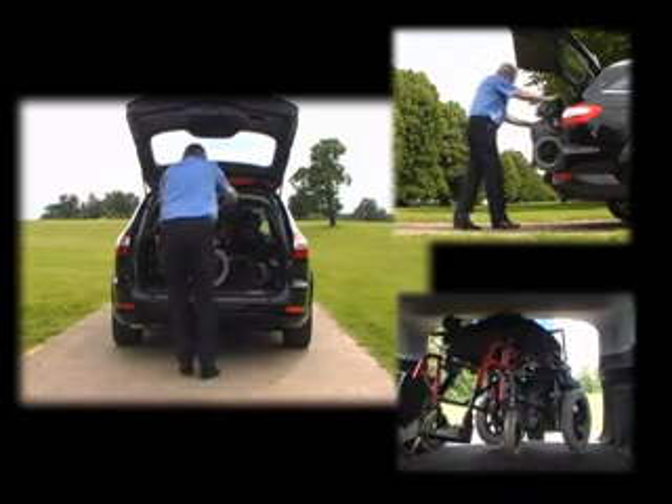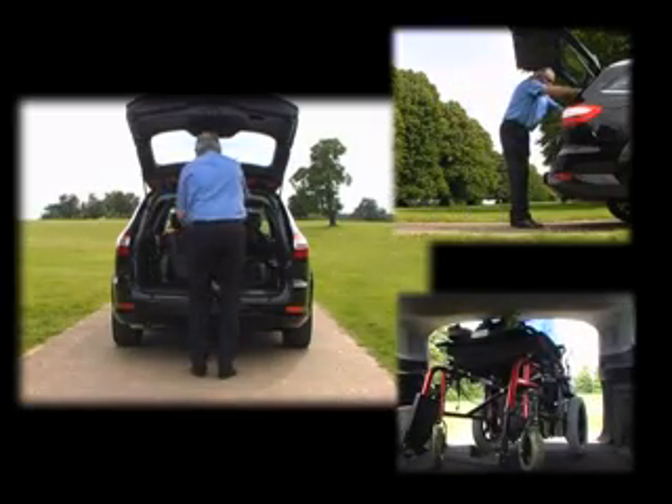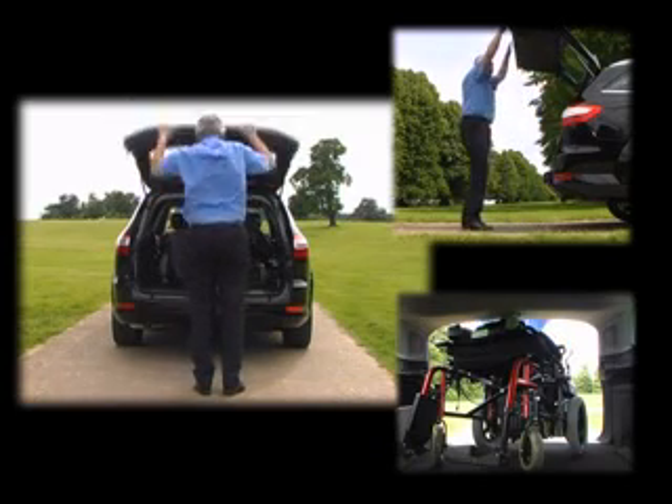The boom of the hoist can be lifted out when not in use and stored in the boot area, or left at home when extra space is required.